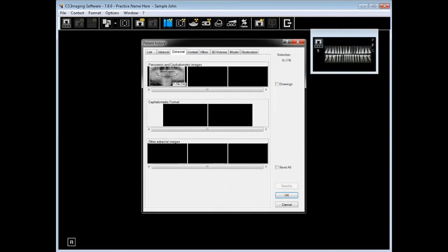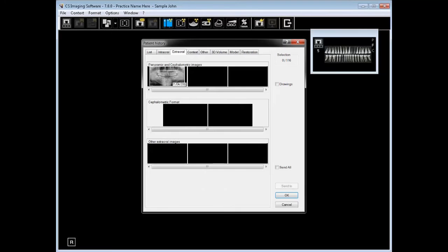Extraoral. Extraoral tab, you'll see a list of panoramic images, cephalometric images. Superimposition for cephalometric will show as a cephalometric format. And intraoral images that were classified as extraoral.